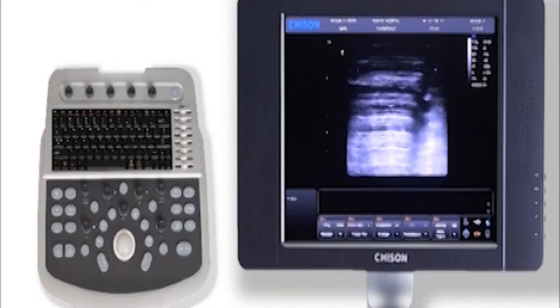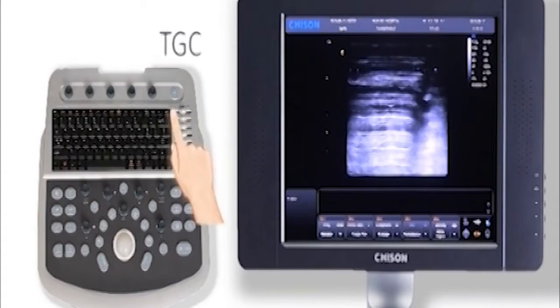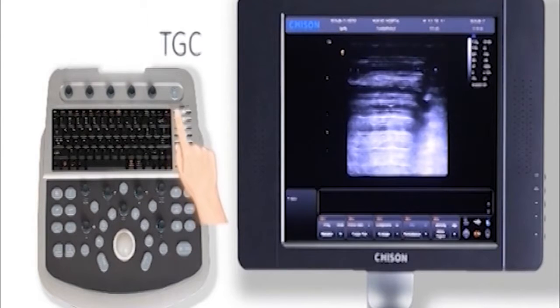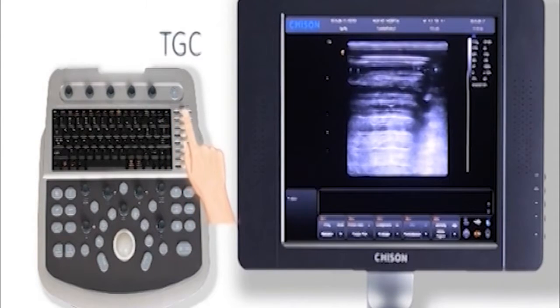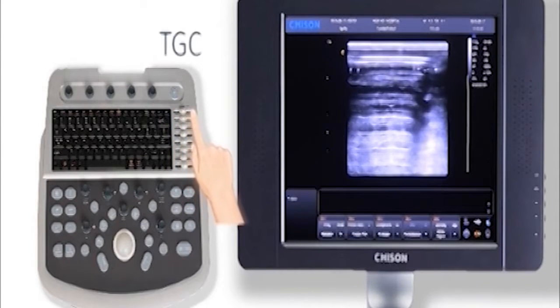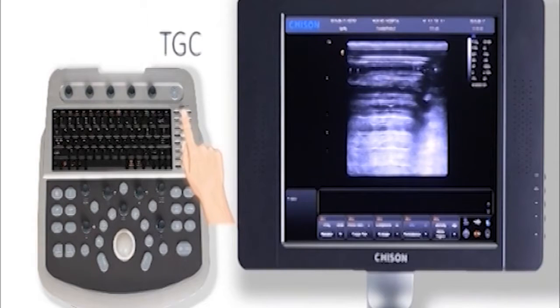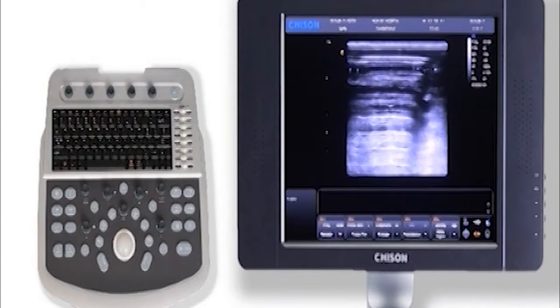TGC, from top to bottom, adjusts depth uniformity of brightness. For example, if the near field has low echo, slide TGC to a relatively higher level so the image is more clear.